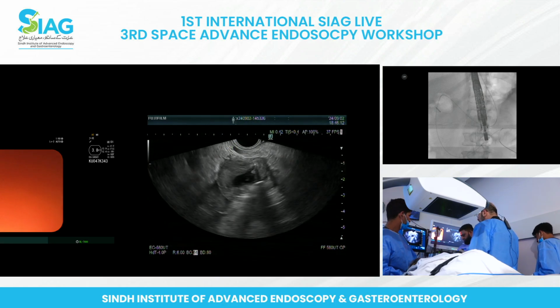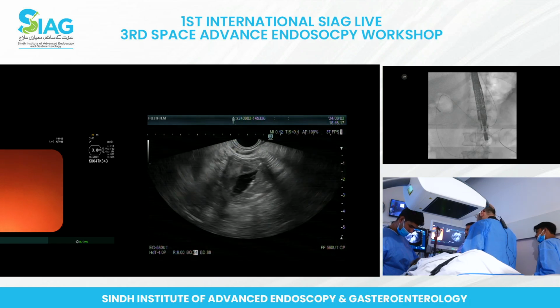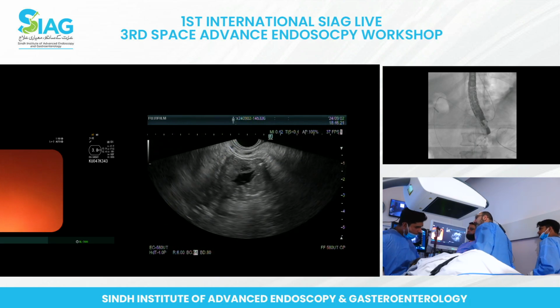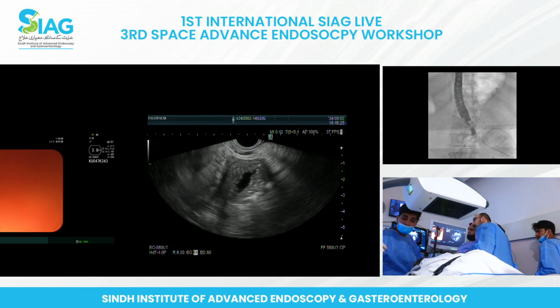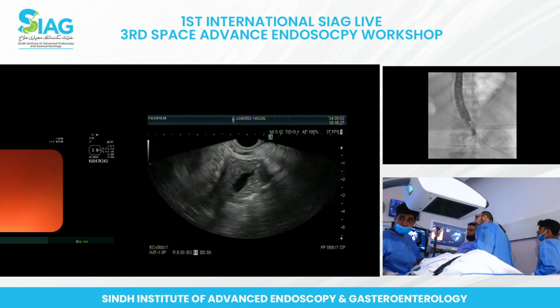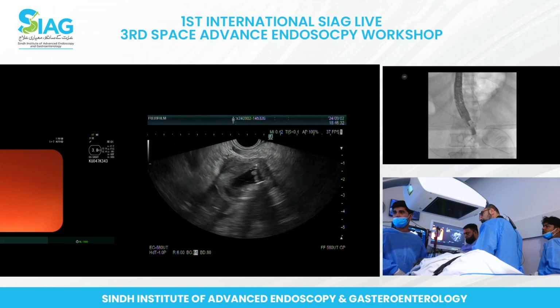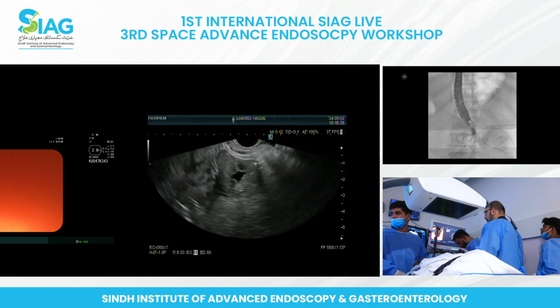is make sure that my small intestine is distended adequately. So we're just filling water contrast mix, and you can see some contrast on the fluoro image. But can you show us the fluoro image, make the fluoro a bit smaller, maybe we'll see it a bit better. You see the balloon there, you started filling up the system there.